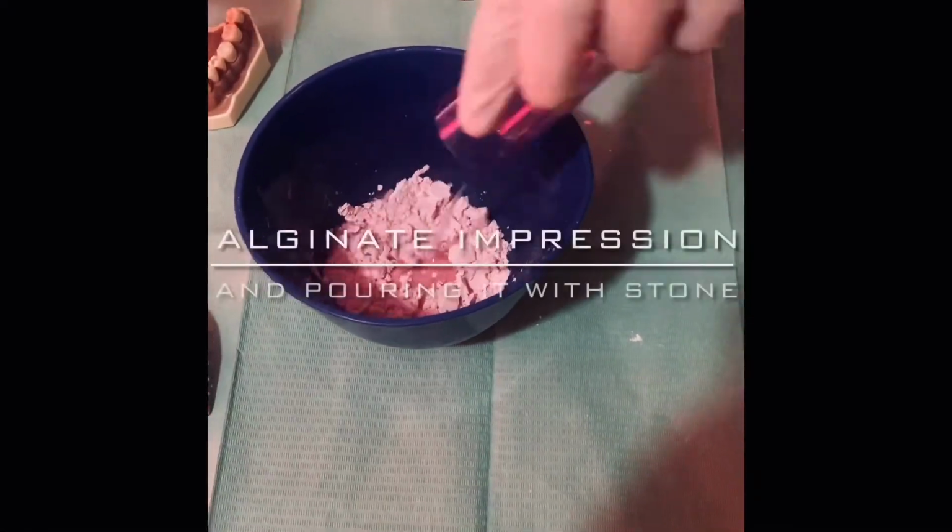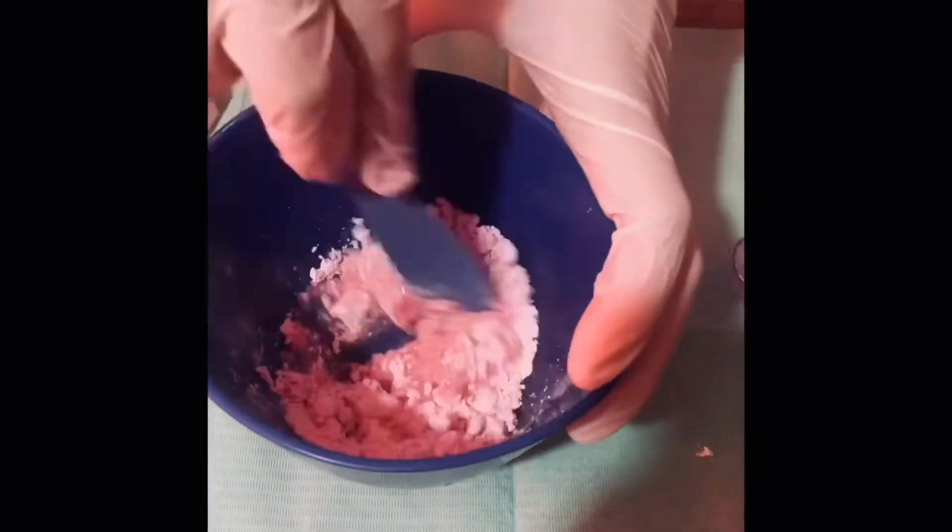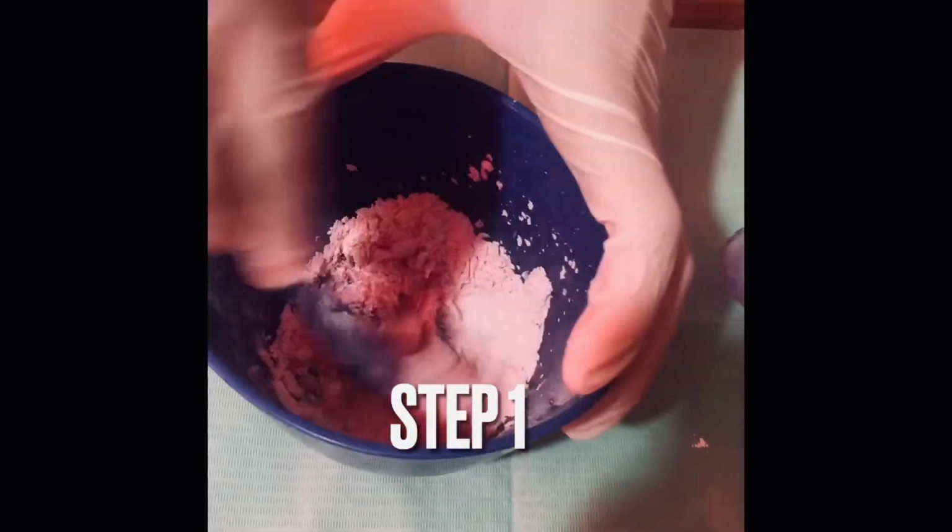Hello, today I'm gonna show you how to take an alginate impression and pour it with a stone. The first and most important step is to have a good and smooth mix of alginate. Always make sure to use the scoops that come with it.